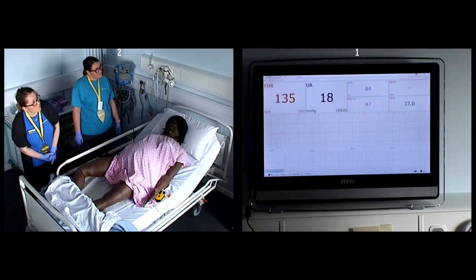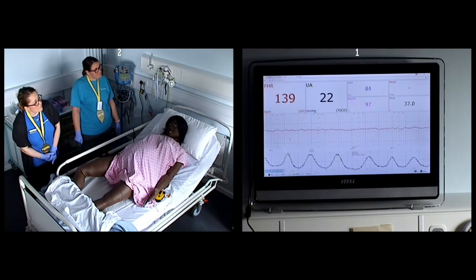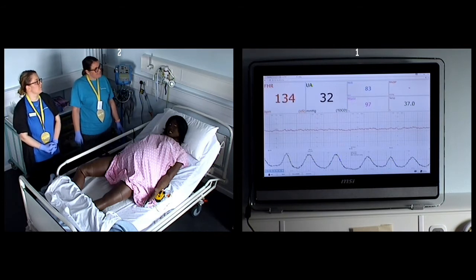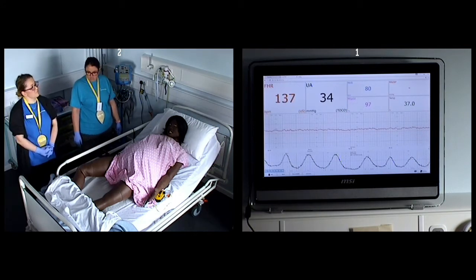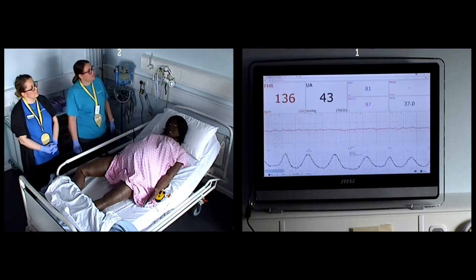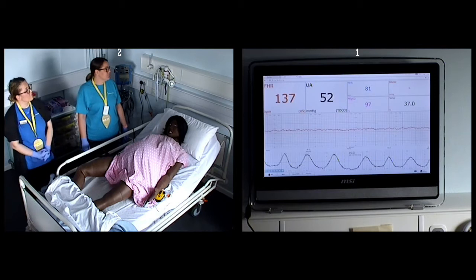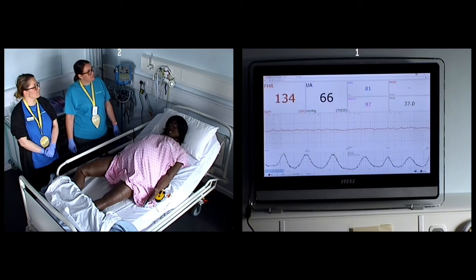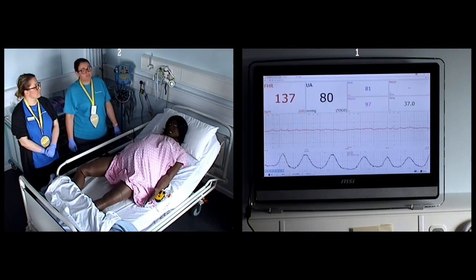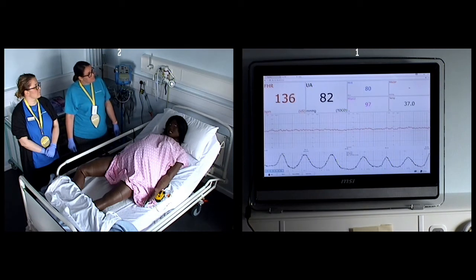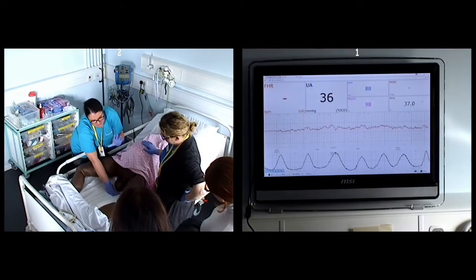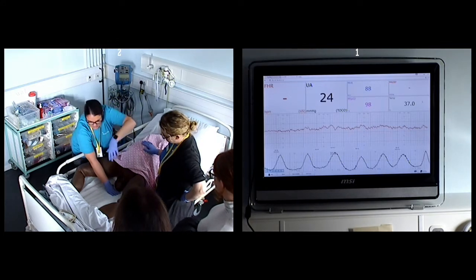We also have CTG monitoring — this is as if the mother is hooked up to the CTG, measuring contractions going up and down and measuring the fetal heart rate. At the moment the fetus is asleep, but I'm going to make it awake so you can see a bit more activity. You've got fetal heart rate, contraction strength, and then the maternal heart rate, sats, and temperature on the other screen — a summary of that.